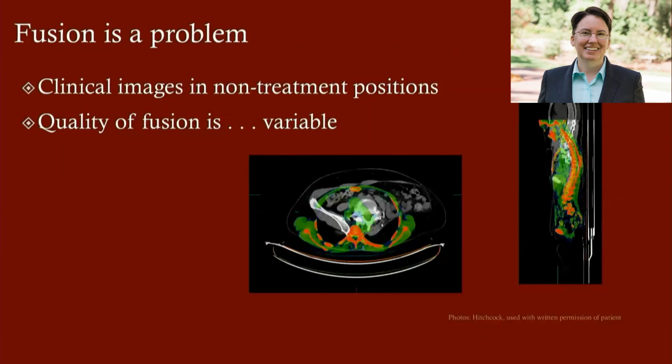If you're using MR imaging in order to do tumor delineation, in order to treat your patients, you know that fusion is always a problem. I brought you one of my favorite fusion examples here. This again came from an outside facility. This was a PET CT as it was sent to me. I hope I don't have to point out to you that the fusion was not exactly high quality here.